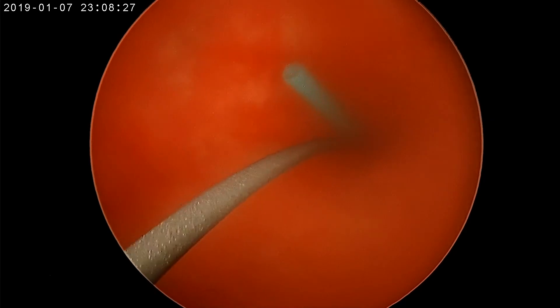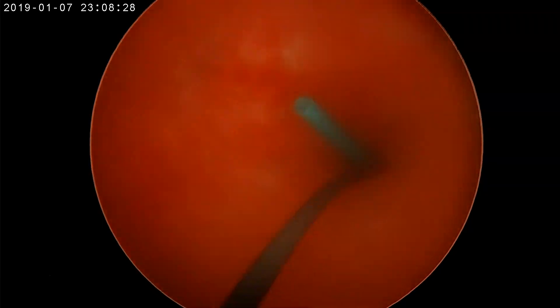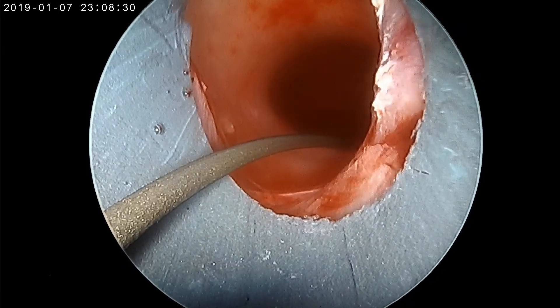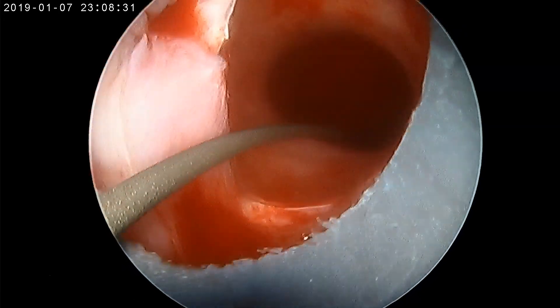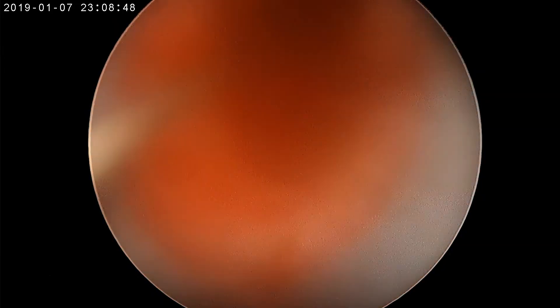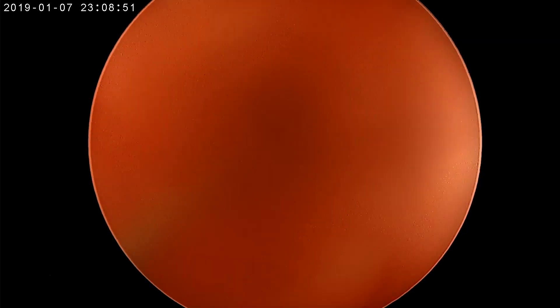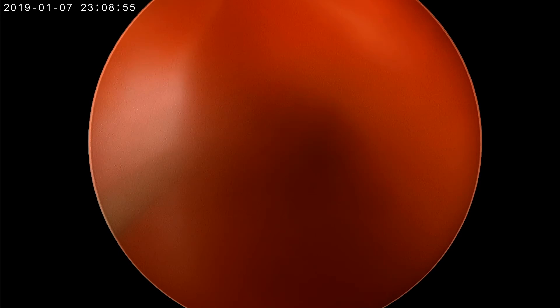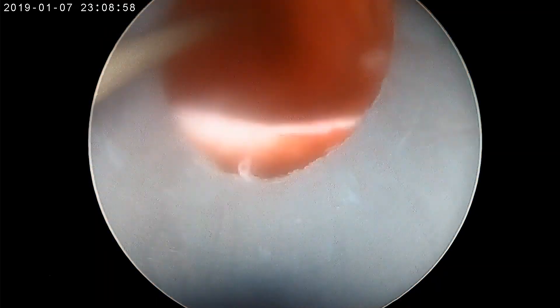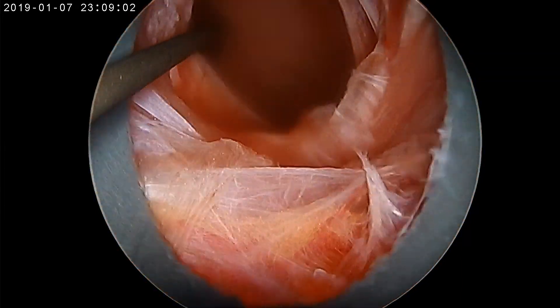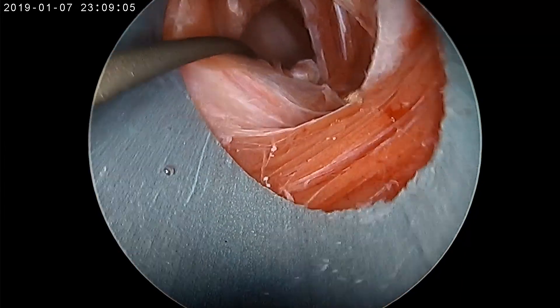At the end of the procedure, the pelviureteric junction and the mid posterior calyx entry point are clearly visible. The papilla is also seen on the right side. As the Amplatz sheath is withdrawn, the tract is visible — the renal capsule is clearly seen, followed by the intercostal muscles. This was performed as a tubeless procedure.